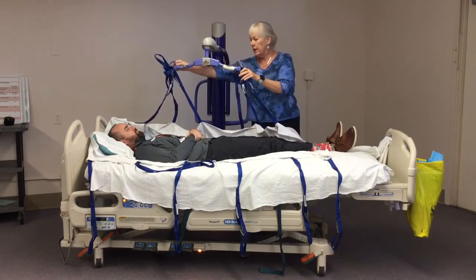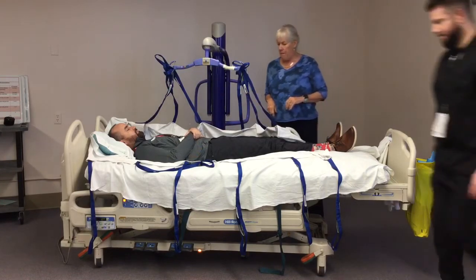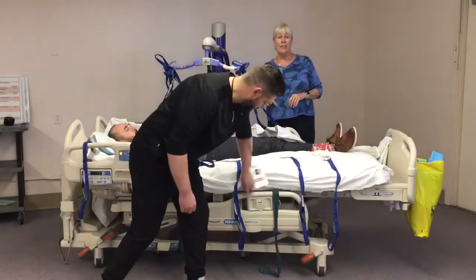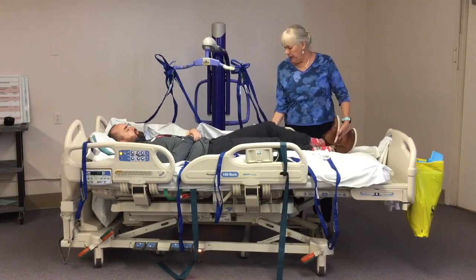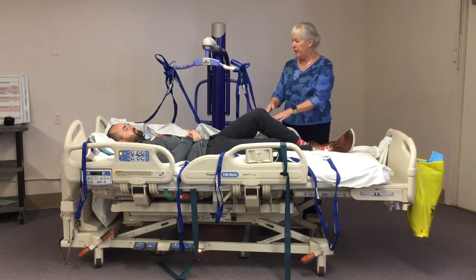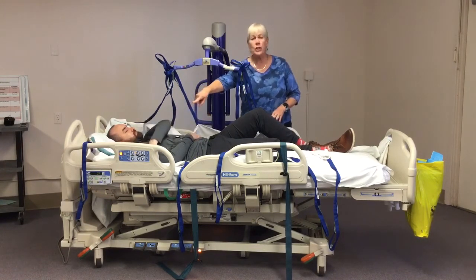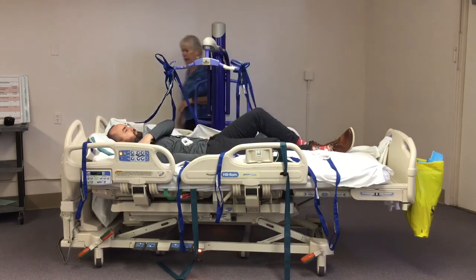Okay, always rechecking these. Now you can ask your partner to get that bed rail up on the other side. And if your patient can, they're going to help you. You're going to ask your patient, can you bend up this knee a little bit? Okay? And if you move it in that direction, 16% of his body weight's already going in the direction you want. The other thing your patient can do to help is they can take their arm and reach over. If they can't grab the bed rail, it doesn't matter. Just the process of reaching is going to help us going in that direction.